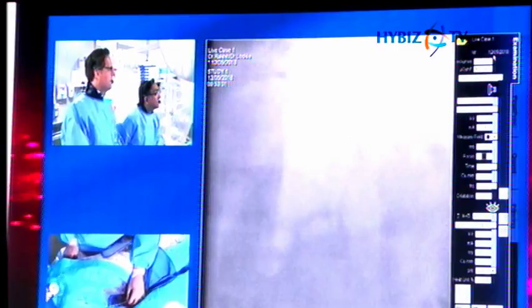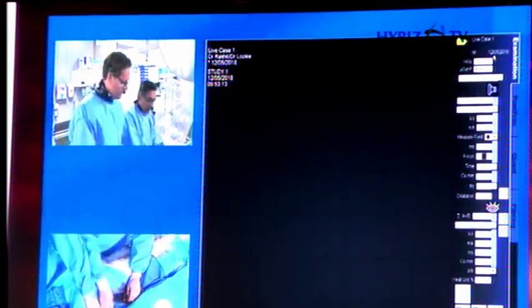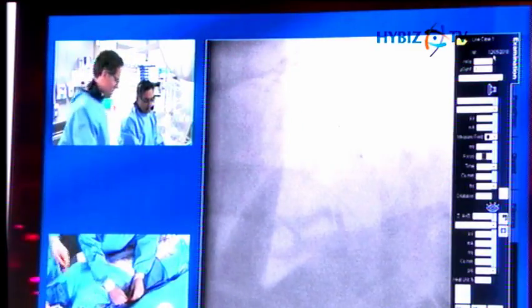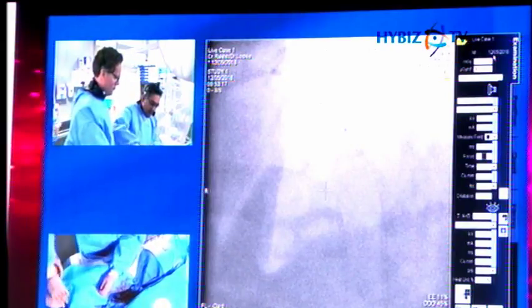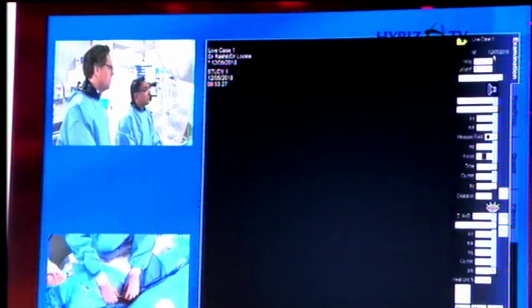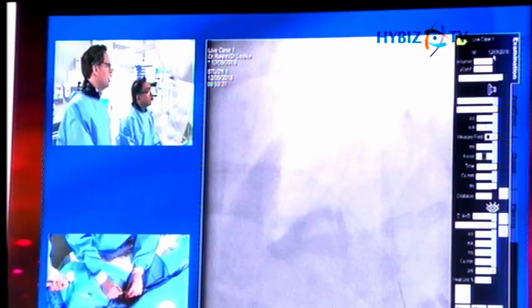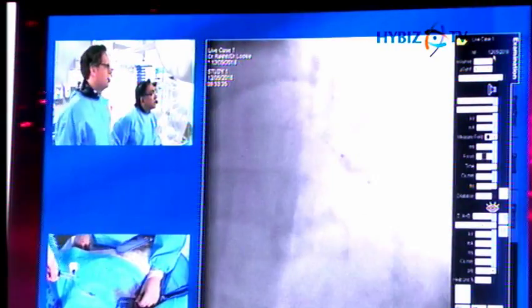Are you planning to image this after? We are, but we want you to see the conformity and rigidity of the stent, which is actually beautiful imaging. The second one, it's not attached properly. Can we have another indeflator, please? Give me some contrast. Should we go up there? Just to 6. Come down. That's down from 6 atmospheres, but it's just a 5mm Emerge NC balloon.